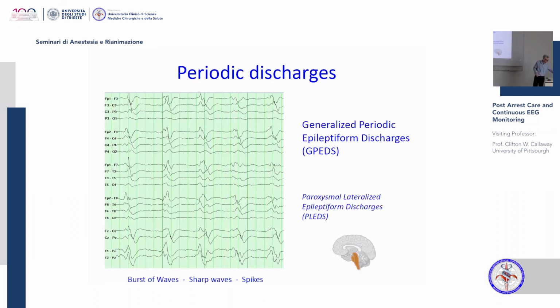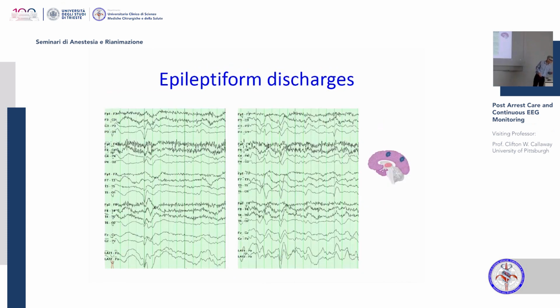They are something firing in the brain. And kind of think of them like bad spots in the brain. Something in the cortex is giving off these epileptiform discharges. And maybe it's a little area of brain damage. Maybe it's inflammation. Maybe you can recover, maybe not. Maybe it has good brain around it. Maybe it has no good brain around it. But the thing is, there's a little focus, which I've made like little blue stars on the brain that look like areas of very focal sources of discharges.